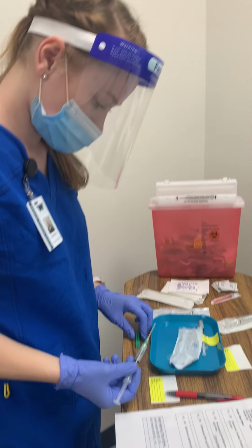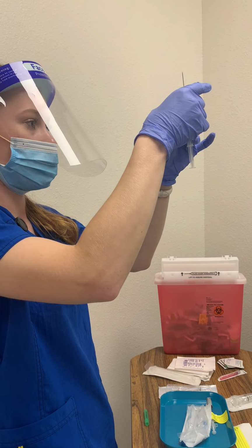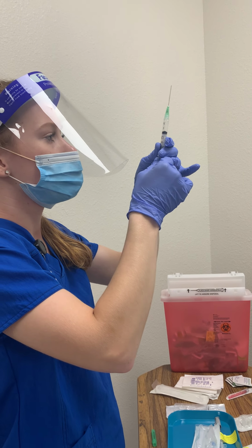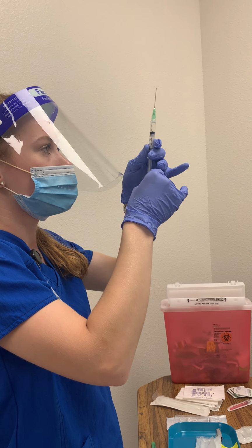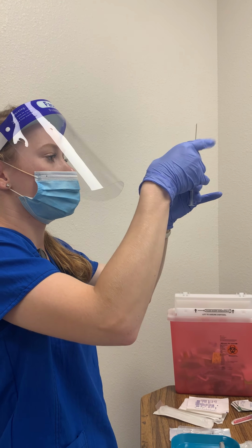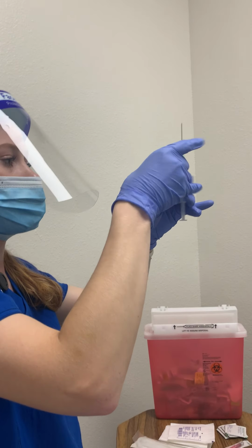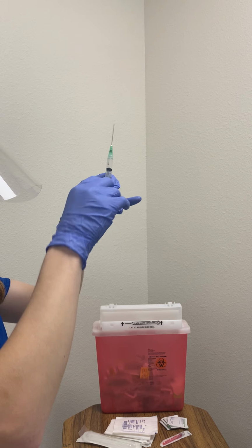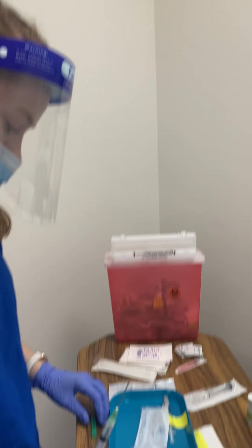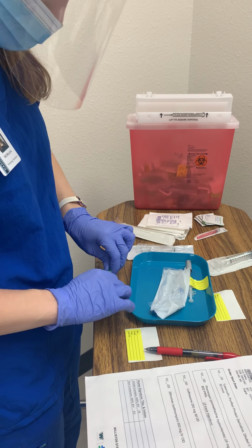And then I'll be flicking out the water, the bubbles, and then I'll be making sure it is 1 ml. Okay, perfect. So it is right on 1 ml, so that is good. So my Phenergan is good. So I'm gonna recap this one-handed scoop, and then I'm gonna put it back on.